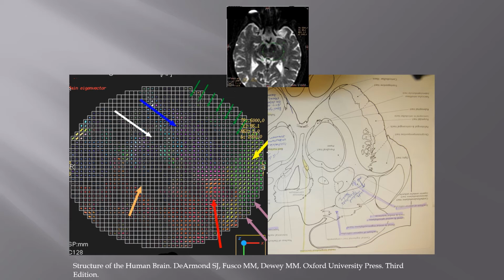So if you're making a tract here, going from the lateral geniculate into the optic radiation, you get a number of fibers twisting back to the occipital lobe. You get some fibers going up more anteriorly into the temporal lobe, forming Meyer's loop before they turn and then head back to the occipital lobe. So again, basically you're making these white matter tracts.